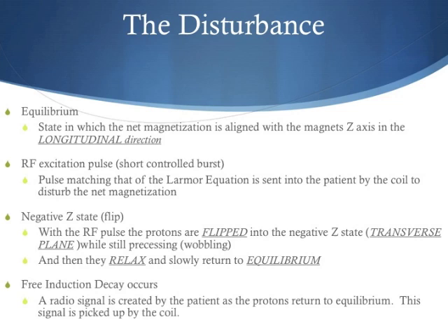Okay, so as this proton, now think about it again, it was pulled to the longitudinal plane of the magnet. The proton was in the z-axis direction as the patient enters the magnet. Then we sent in an RF pulse, an excitation pulse, which pushed it down to the transverse plane. Then, as soon as the pulse stops, what did I say? I said the proton starts going back to the z-axis or the longitudinal plane.